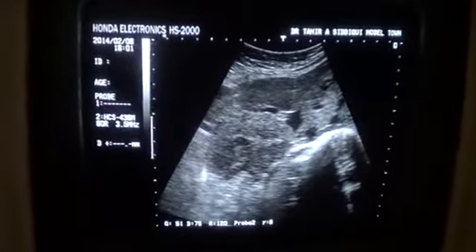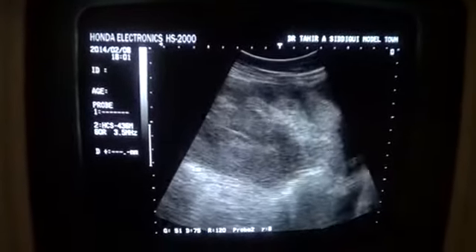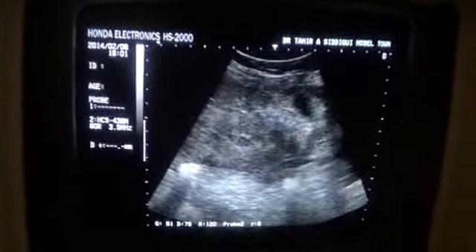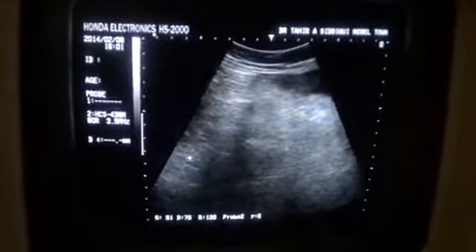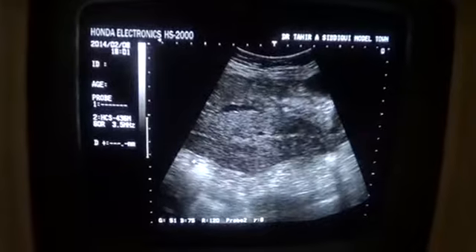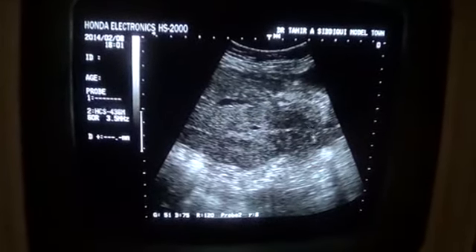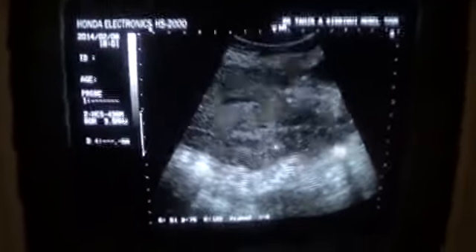This is the ovary, right one, and if I can get you the left ovary, would be a plus point for me. Presumably this is the second ovary, the left one.